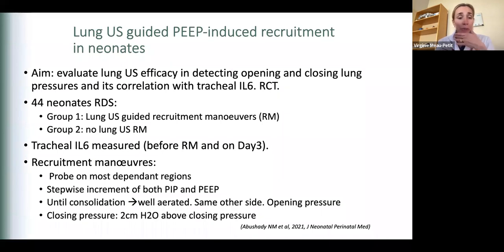So what's been published in neonates? Only 2 studies, well, 2 teams, 3 studies in neonates. It's really a developing field, and I think we really have to work and probably do similar studies as from adults in neonates, except we don't have a gold standard. But 2 studies evaluated the efficacy of lung ultrasound in detecting the opening and closing lung pressures, again to find this safe window of ventilation.